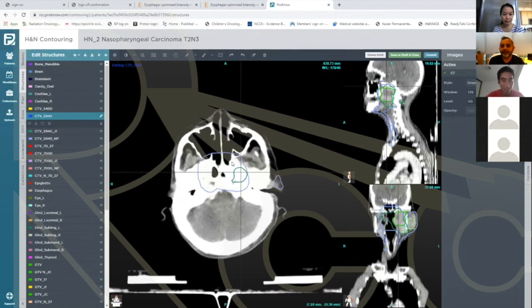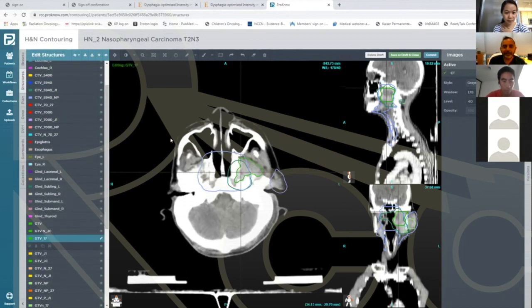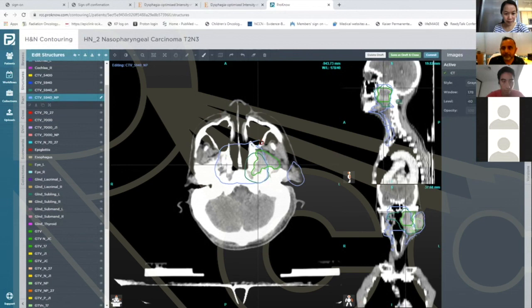Perfect. And then when you come here though, right? So now let me turn on those really nice volumes from number 17. Okay, so here you can see this is where no textbook is going to show you how to draw this. None, right? So let's see, if I were to take this, let me see if I can do this. But you know now in this patient here, okay, this looks good. But here, you need to include the entire infratemporal fossa in this patient, okay?